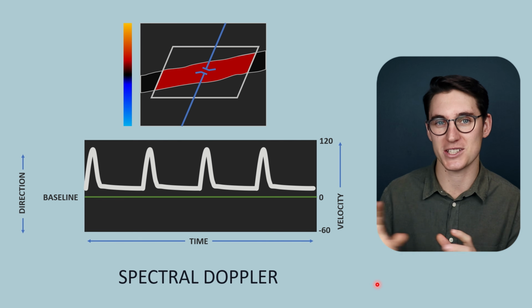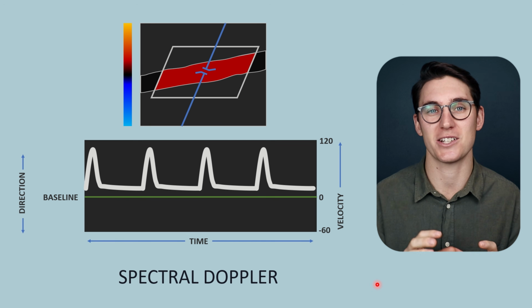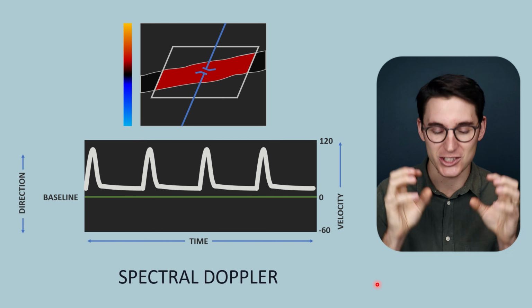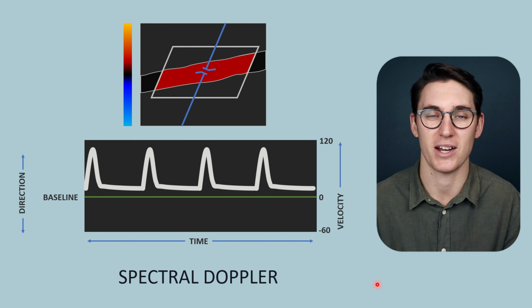We're not going to be focusing on actual clinical outcomes, and all of my schematics here are diagrammatic representations of the spectral Doppler waveform. Nothing here is extremely accurate. I want you to get the concepts over actually measuring specific values.